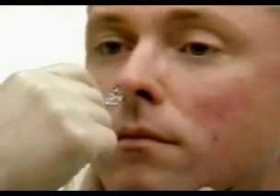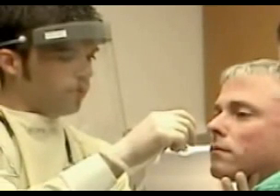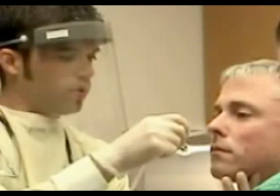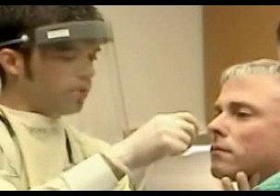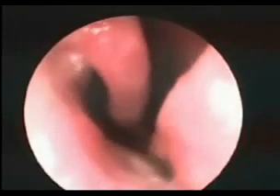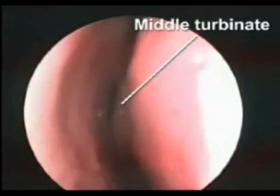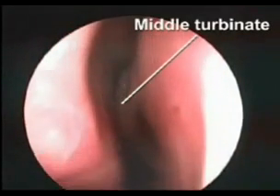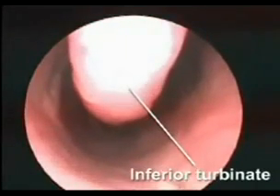Position the patient sitting upright in the sniffing position. Insert the tip of the nasogastric tube into the nasal cavity and slowly advance it posteriorly, parallel to the floor of the nasal canal. The tube should not be directed upwards. In this endoscopic view of the nasal cavity, note that if the tube is passed in an upwards fashion, it will reach a blind recess at the middle turbinate. When the tube is passed parallel to the nasal floor, it reaches the posterior nasopharynx without difficulty.